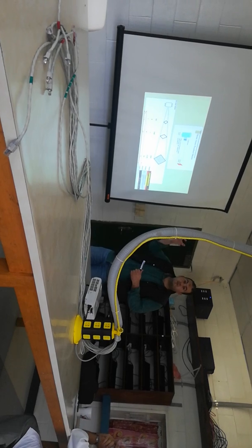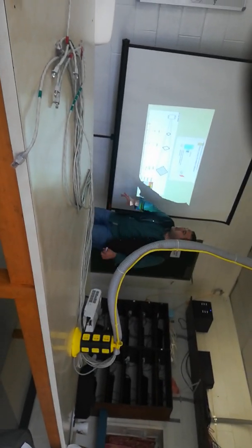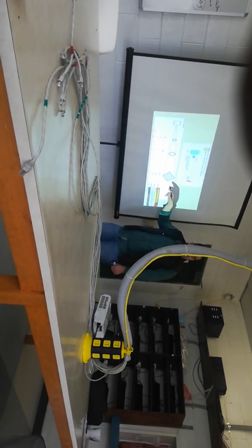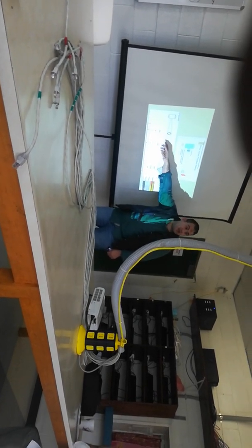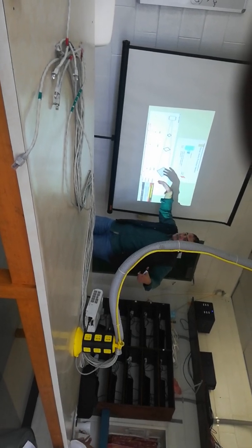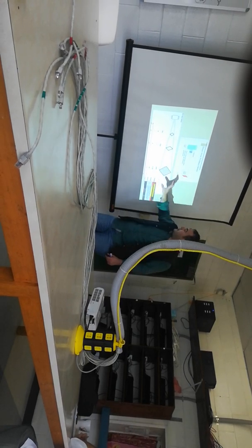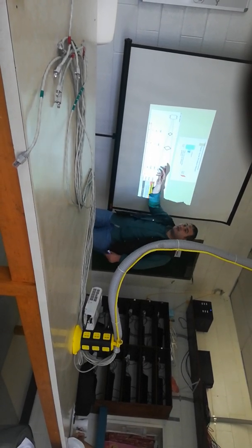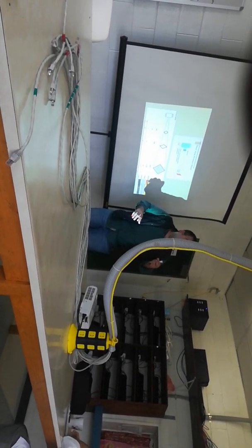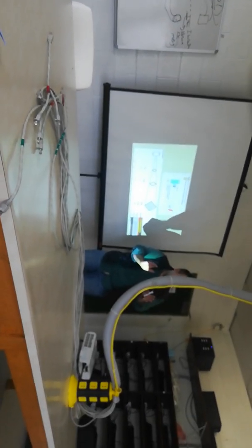Here, what is the meaning of dose area product? Here, this is the X-ray tube. With increasing distance, the area exposed to radiation will be bigger, greater. So here a small area is exposed, here larger, here larger. At greater distance the exposed area will be greater, but the intensity of the radiation, the number of photons, is still the same.